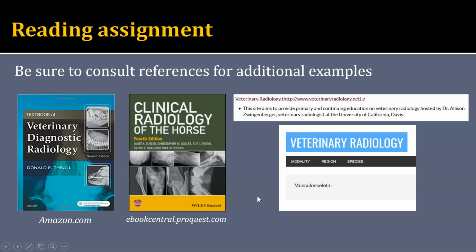And then once you view the images and make your own list of findings and conclusions, you can access the tabs that have her findings and her conclusions for the study. So that should be able to give you some more practice, because remember that it really is practice that you need to help you feel comfortable identifying the abnormalities and coming to good conclusions.